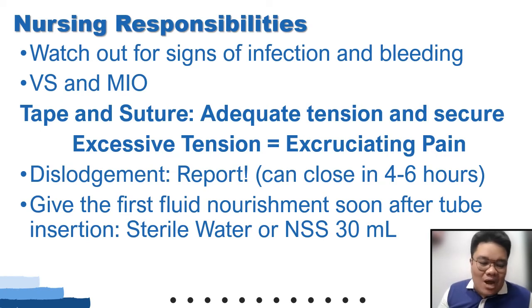We are not the one licensed to reinsert the tube. If you would want the tube to be reinserted, that will be your surgeon who will be doing it. Because class, if that will not be reinserted, the tube can close in 4 to 6 hours. Okay, 4 to 6 hours.